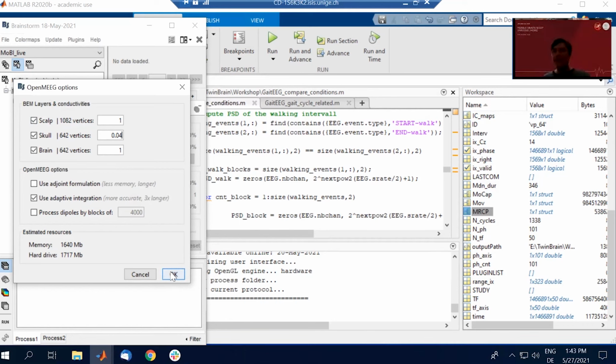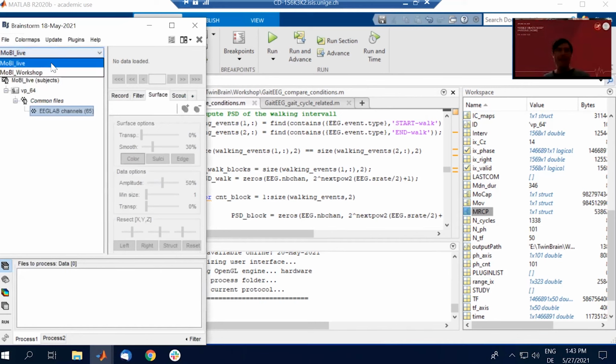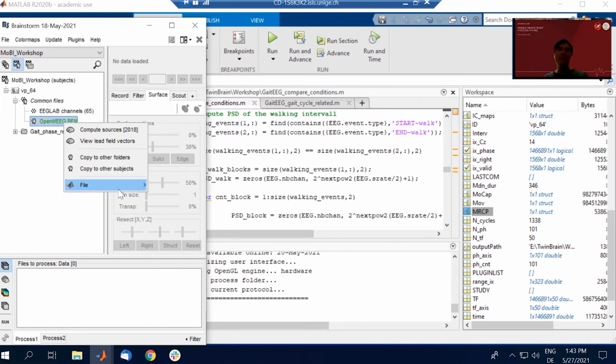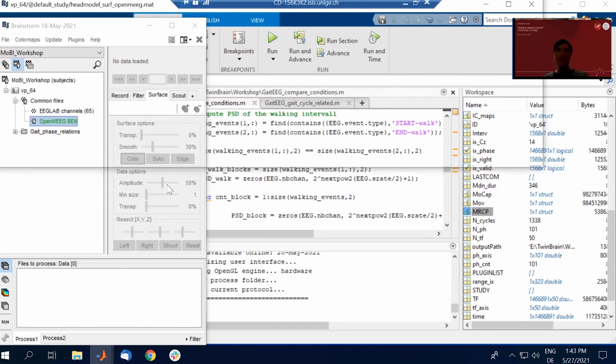I won't spend 10 minutes waiting now. That's why I prepared something. It's exactly the same thing here, but here in common files, I do not have only the channels. So let's erase the things I didn't explain. Let's say I did this, it was running 10 minutes, and then I just have the channels and the OpenMEEG BEM. We can also look at those guys and look in the contents.